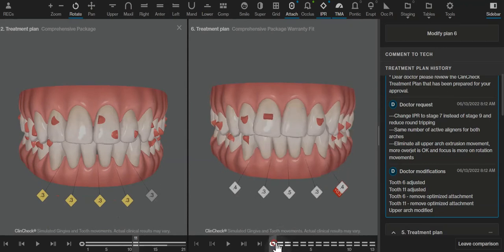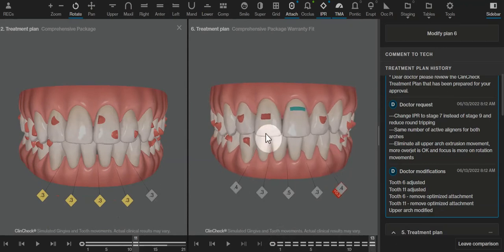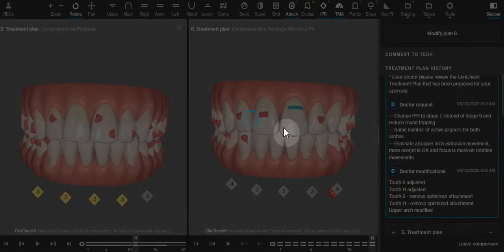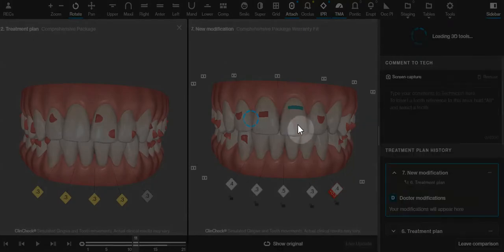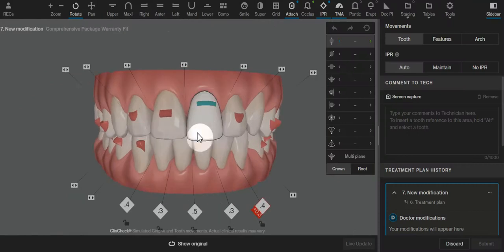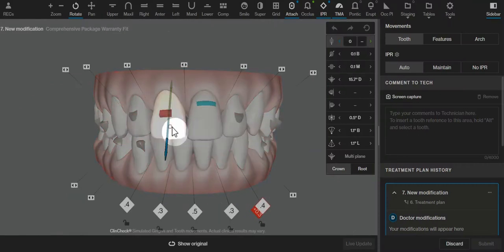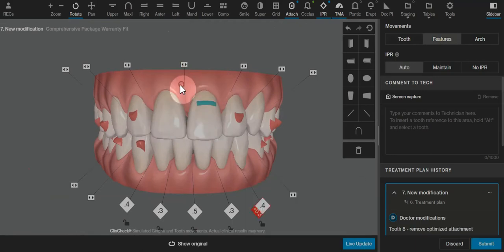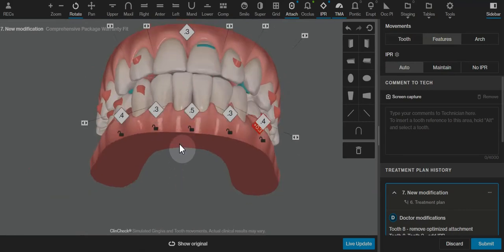The other thing I see is that I want to check if there's extrusion really planned on this tooth and if we need this attachment. And also, since I do have a little bit more lower IPR, and I see that these teeth do finish with a black triangle, that is one where, since it's no longer extruding, we can remove the attachment. I may just want to kick up the IPR here just a little bit, and that's doctor preference.